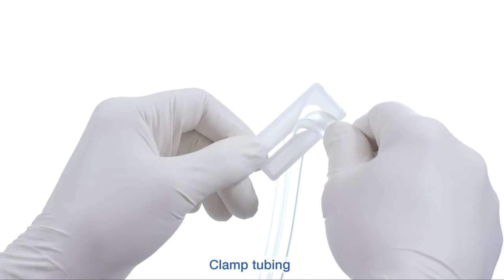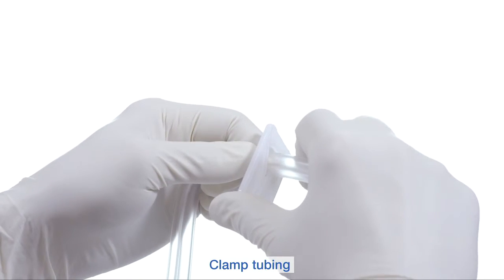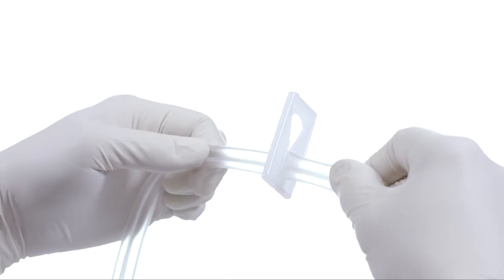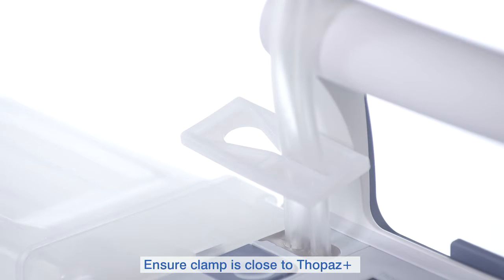To change the canister, you must first clamp the tubing. Clamp as close to the canister as possible to prevent fluid leakage once the canister is removed.